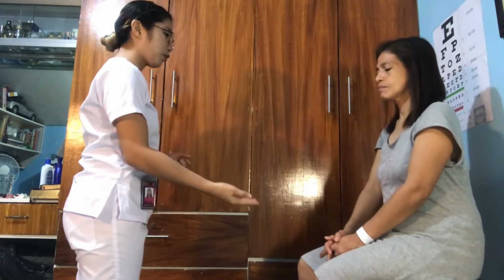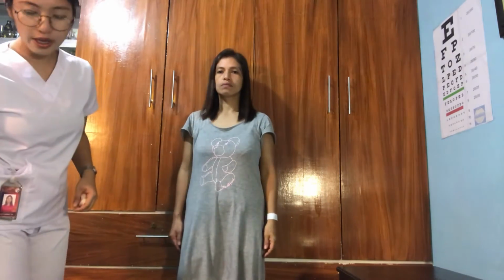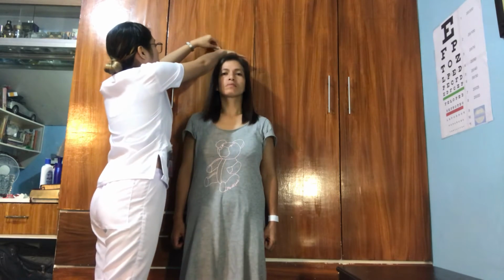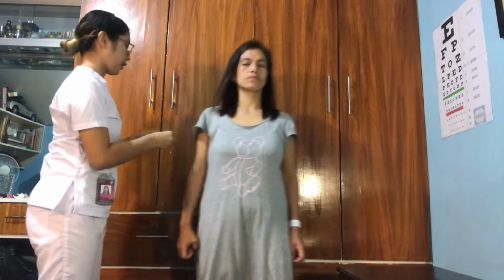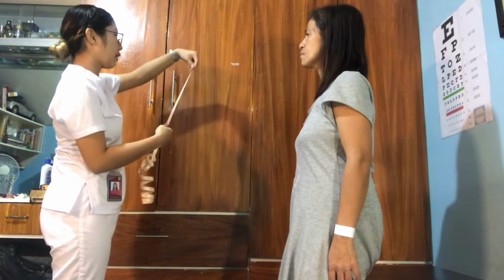So Mrs. Tia, tayo po muna tayo. Kukunin ko lang po ang inyong height. Okay, tayo po muna tayo dito. Straight lang po. Okay? So to assess the height of the patient, since I am using a measuring tape, I will be using a mark to mark the height of the patient, and later on I will measure it through the use of the measuring tape. Okay po, sige po. So I will be measuring the height of the patient in centimeters.